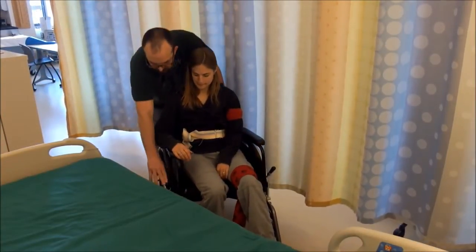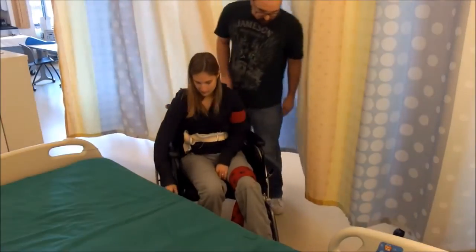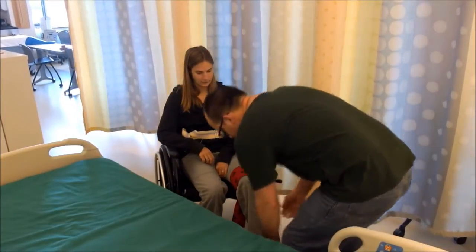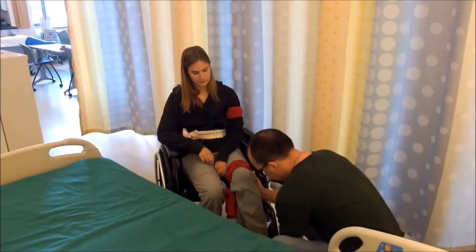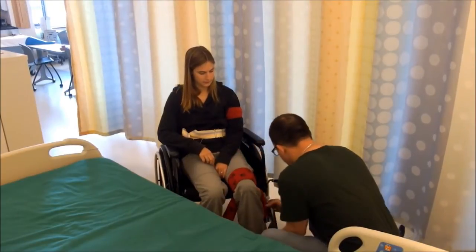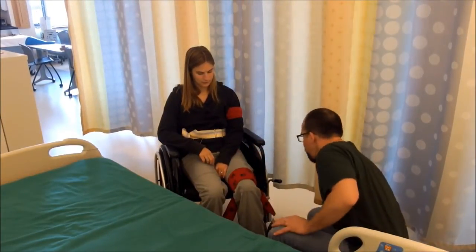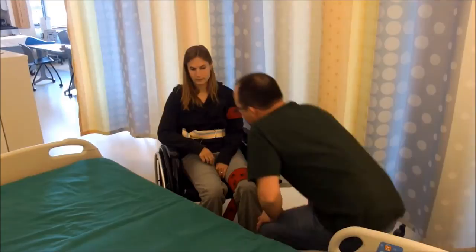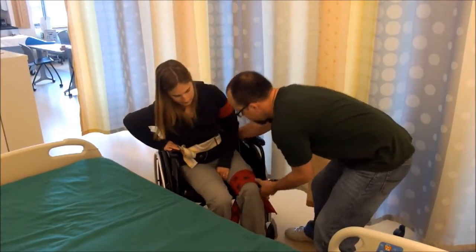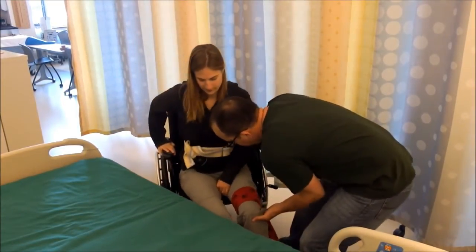Encourage the client to do as much on their own as possible. Remove the footrest on the affected side. The caregiver uses the hip on the client's affected side to assist in scooting forward to the nose over toes position.